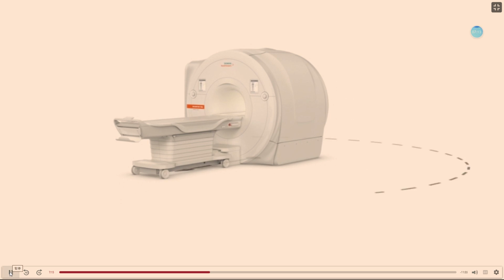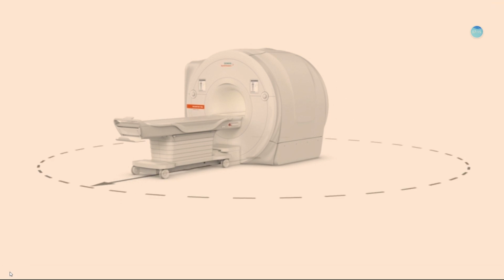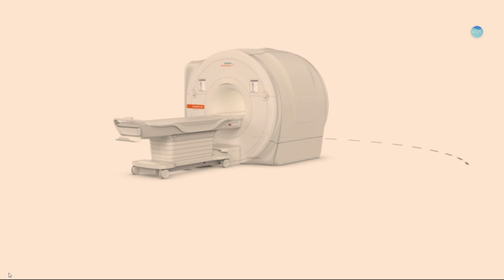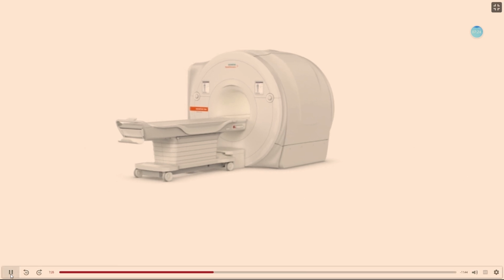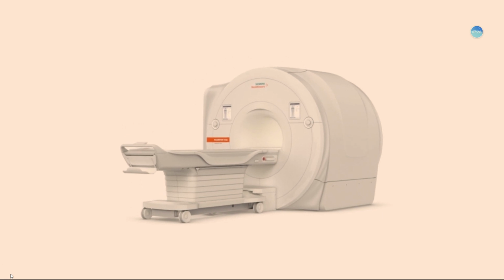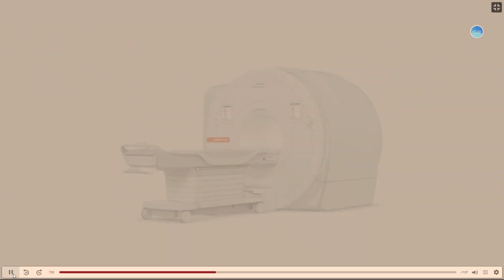The controlled access area encompassed by the 5 Gauss line for the field strength is established around the MR magnet and is clearly marked on the floor. In the case of a typical MR system, it is a few meters from the magnet center inside the RF cabin.